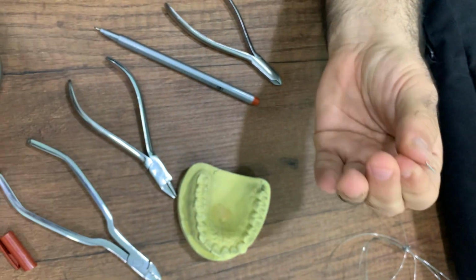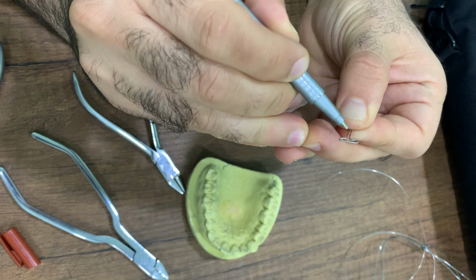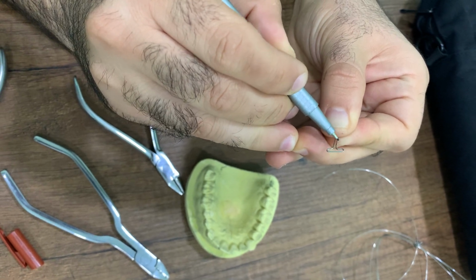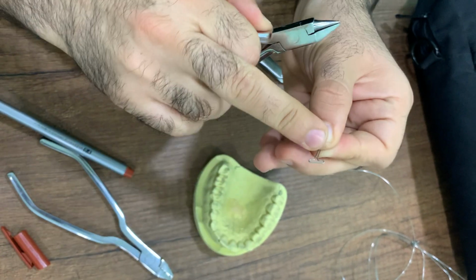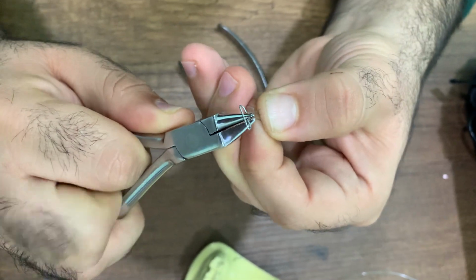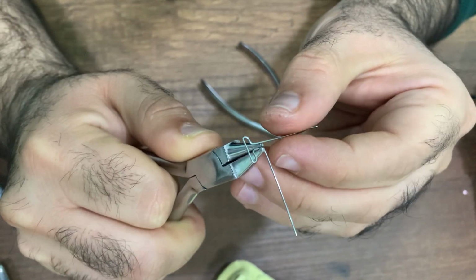Two arms extend down about 3 to 4 mm, and are separated by about 0.5 to 1 mm from each other. At the middle of the vertical arms, we have two adjustment loops at right angle to the vertical arms.